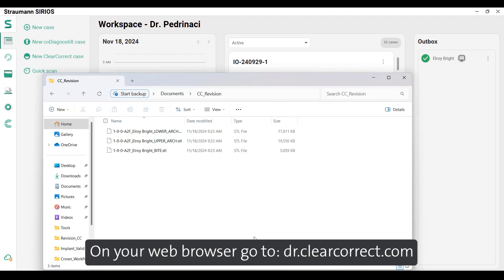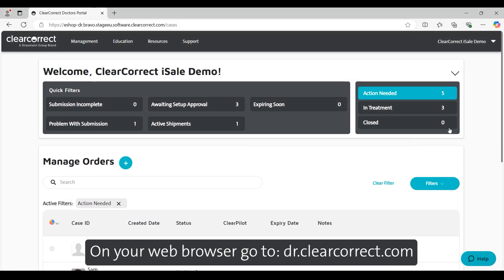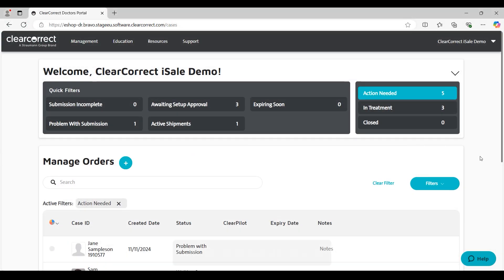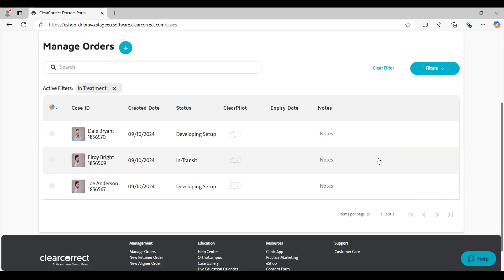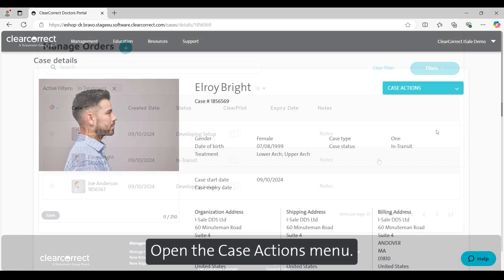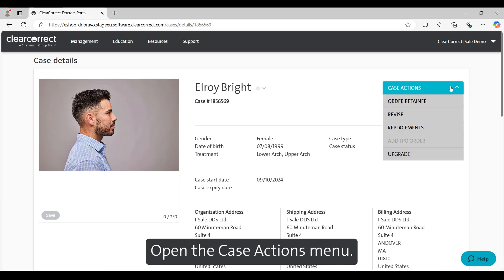On your web browser, go to dr.clearcorrect.com. Log in to your account, select your patient, and open the Case Actions menu.